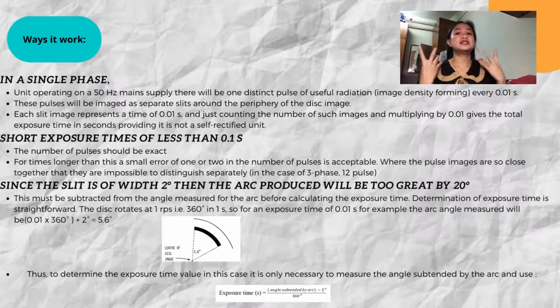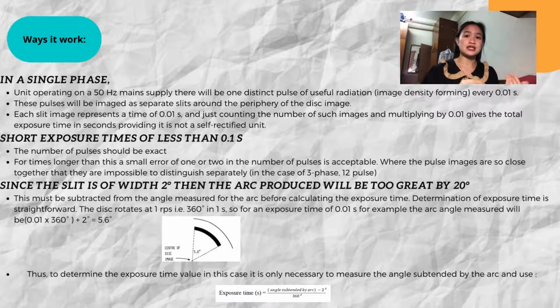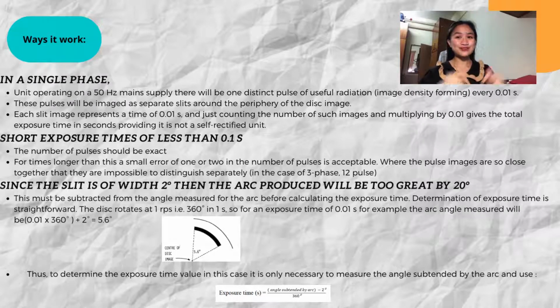Thus, to determine the exposure time value, in this case, it is only necessary to measure the angle subtended by the arc and use the formula that I already attached below.